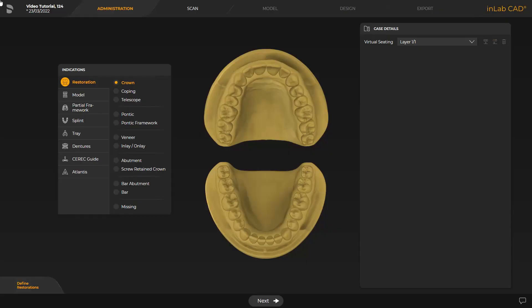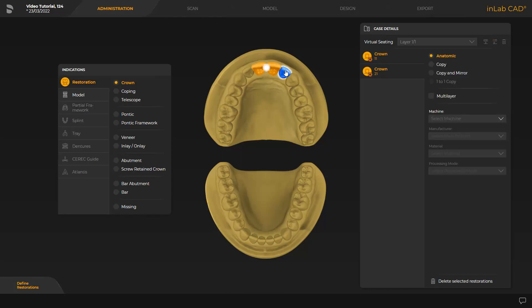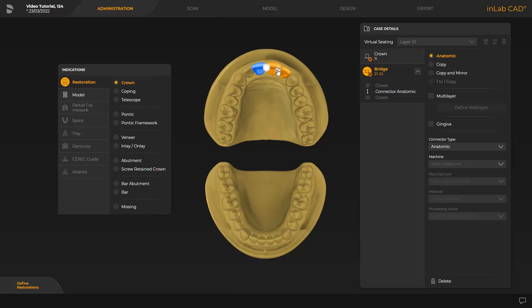Our case concerns designing three temporary front teeth crowns in the upper jaw. To do this, we select the crown option in the administration phase under the indication restoration, then mark the positions in the odontogram. At this point, you can select between designing three separate or connected temporaries. By tapping one of the circular markings, the type of connector to be designed is selected. In our case, this is the anatomical connector.